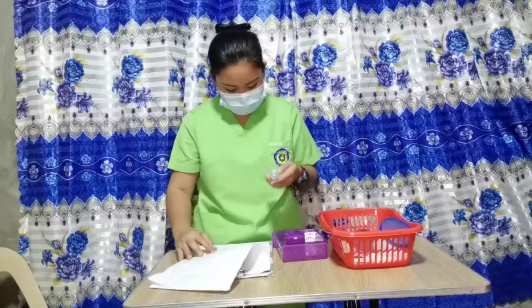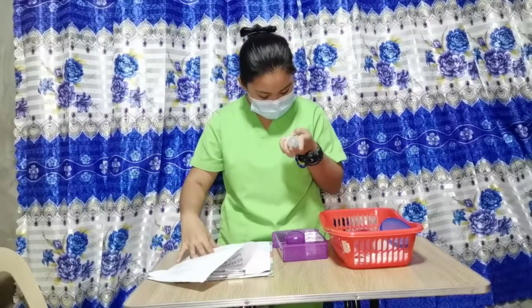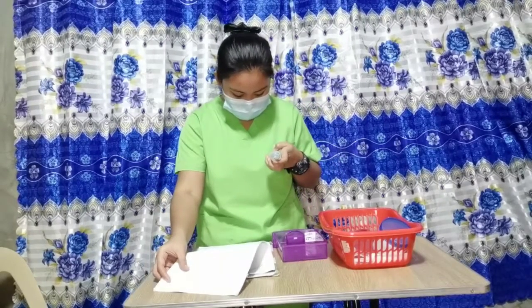Compare the label with the MAR. Check the expiration date and perform calculations if necessary. If necessary, withdraw the medication from an ampule or vial as described in the previous skills.